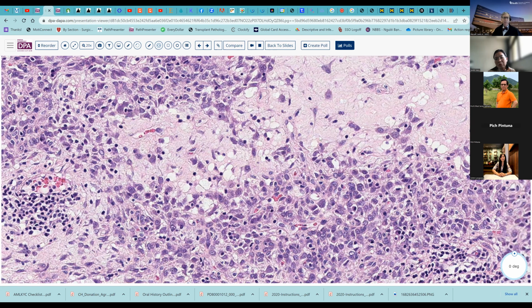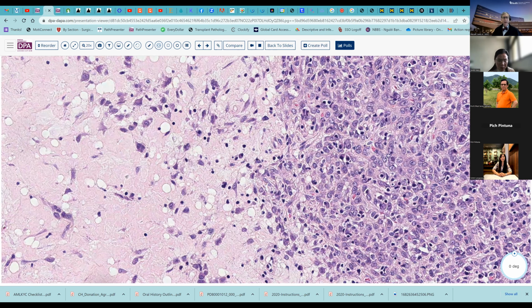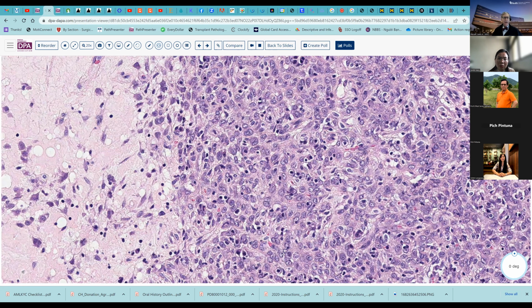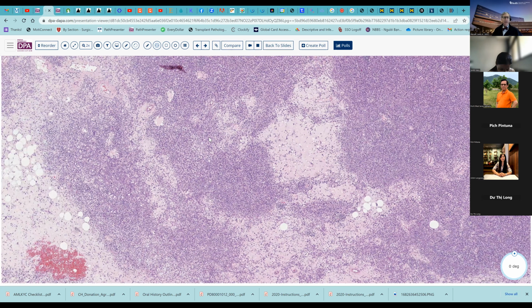And it has this sort of myxoid or edematous tissue in between these cells, which show a little bit more atypia than you might have thought of otherwise. So I think in any spindle or epithelioid neoplasm that you're not clear what it is, adding a STAT6 to the immunoperoxidase profile will be very helpful to you.